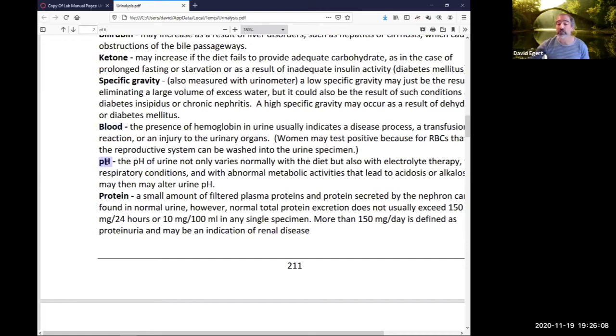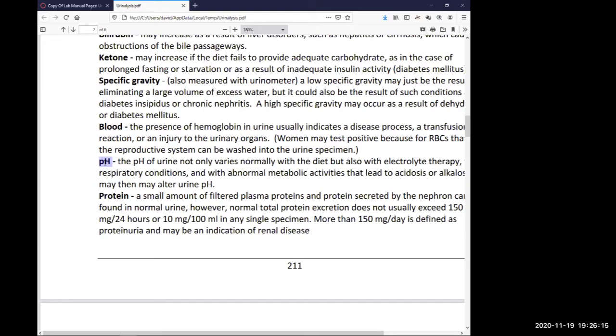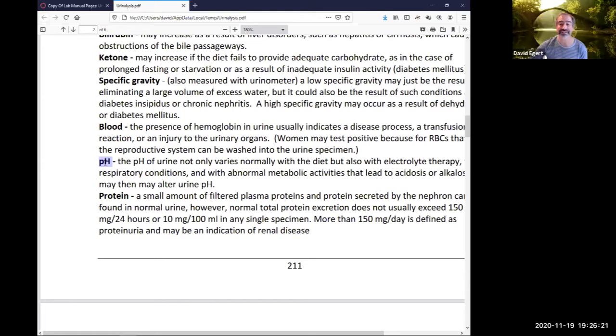pH, what should the pH of your urine be? Or the same pH as your blood? No, not necessarily. A little more acidic. Right, so this is where it's important to remember the function of the kidney, the pH balance. Right, so if your kidneys need, maybe I'll go.